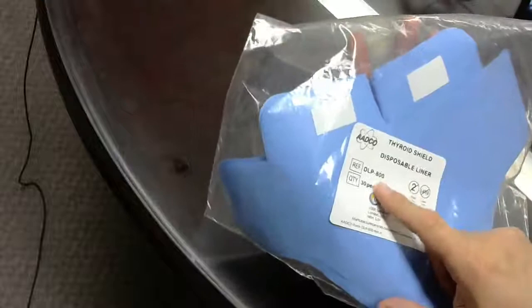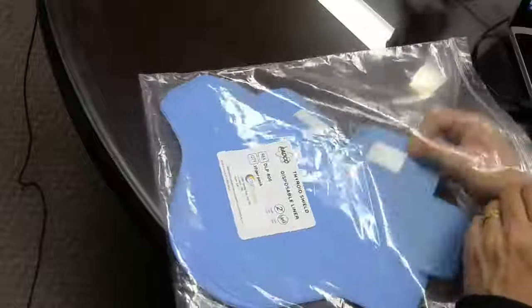There are 30 that come in this package, so I will show you.